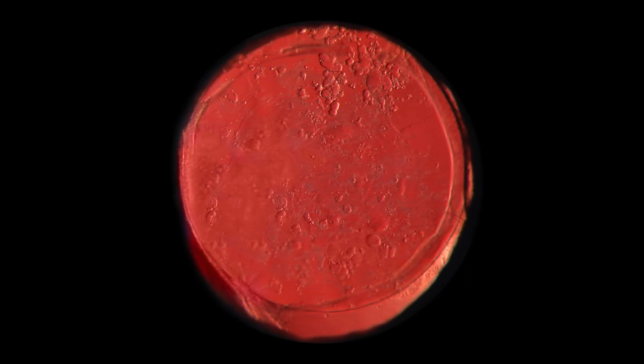Now I will show you the effect from the surgeon's point of view. Here you can see the aiming beams in focus directly on the capsule. They are overlapping, forming one circle. Now pushing the focus about 1.5 millimeters further posterior behind the lens into the vitreous. Two red aiming beams are now clearly visible on the posterior capsule.